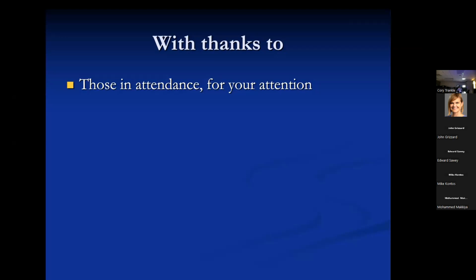The other thing you can do to get better temporal resolution, Mo, is to cut down the number of segments. In GE terminology, it's cut down the views per segment, but basically get fewer lines of K-space with each beat. That way, your temporal resolution will be, instead of 40 to 45 milliseconds, maybe 30 milliseconds. So it'll be better shutter speed, so to speak. But the patient has to be able to hold their breath. It'll be a longer breath hold, okay?